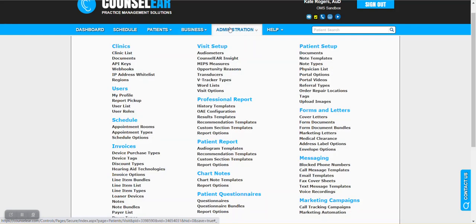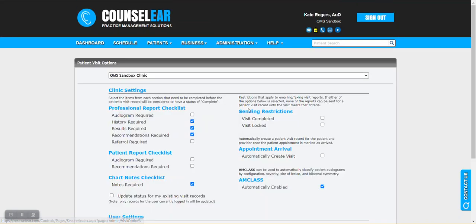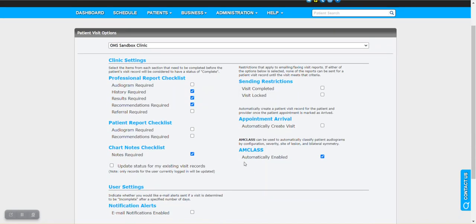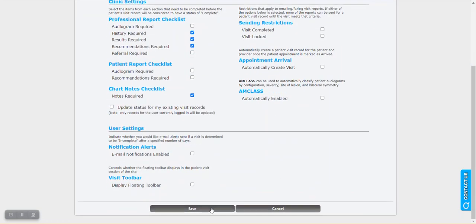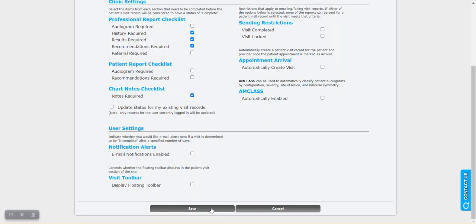Now you also have the ability here under administration and then visit options, if you would like to disable the automatic classification. What this basically means is by default this is automatically enabled, but you can uncheck this and then save. And what that means is that when you either enter audiometric thresholds directly to Counselor or you send them over from NOAH, AMCLAS will not automatically perform the classification. You then can go through and select the different options that you wish. Now it's important to note that in that case you would need to select all four categories: the configuration, the severity, the slope, and the symmetry.